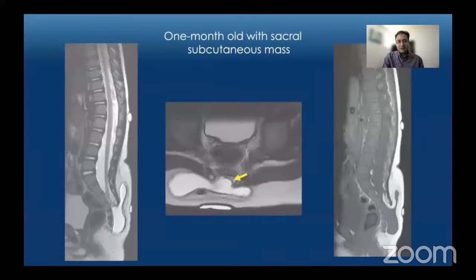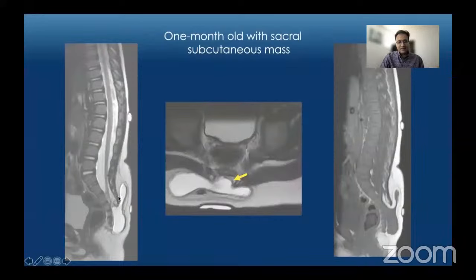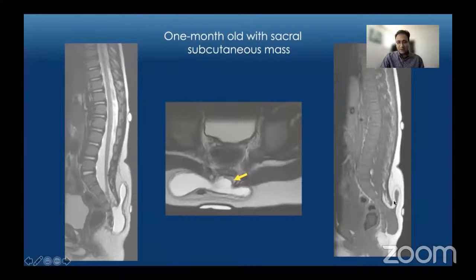On sagittal and axial T2-weighted images we see dysraphism of the sacral region and a cystic mass contiguous with the distal spinal cord. There is no associated lipoma, although there is some continuity of epidural fat with the subcutaneous fat. Importantly, this is a closed defect — the cystic structure is completely covered by skin and subcutaneous tissues.